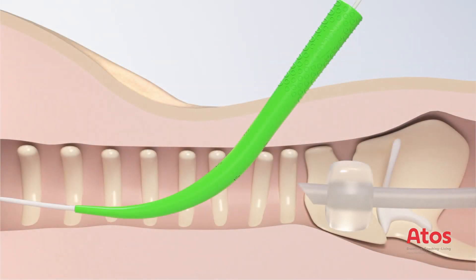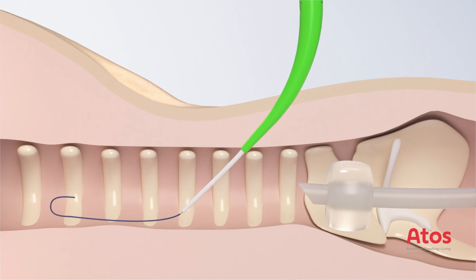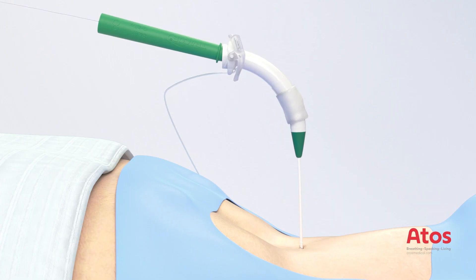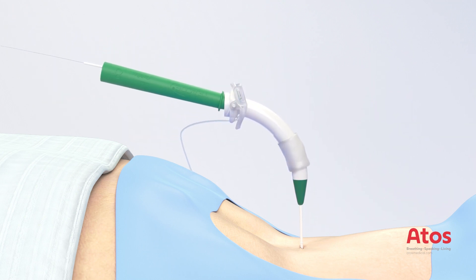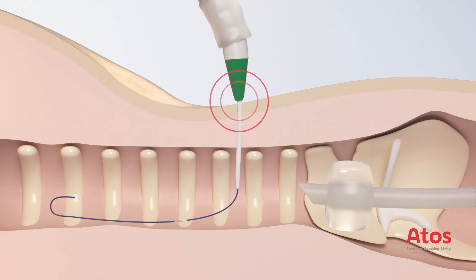For the placement of a Traco Twist P-tube, the expert dilator is removed and the guiding catheter remains with the Seldinger guide wire in situ. Introduce the inserter with the Twist tube onto the guiding catheter and guide wire. Bring the tip of the inserter to the stopper ring of the guiding catheter and position it on skin level.